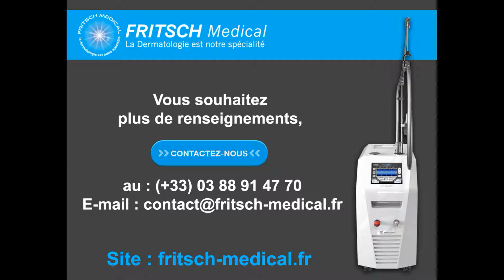But sometimes for a large part of the leg vessel, you treat step by step, every maybe 3 millimeters. You don't follow the vessel completely. You spare a small area between two shots, and you come back to finish between the first two spots. You understand? So it's more precise than for the face. For the face, it's easier to treat only the nose, but be careful of the scar.